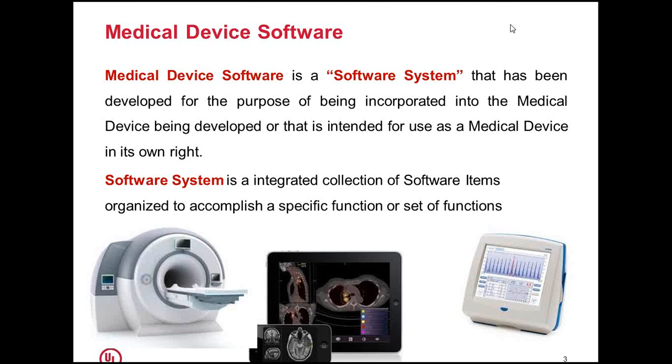What it means is a software or a firmware which is inside a medical device, or a software which itself can be treated as a medical device. Software system: what is a software system? It's an integrated collection of software items organized to accomplish a specific function or a set of functions.